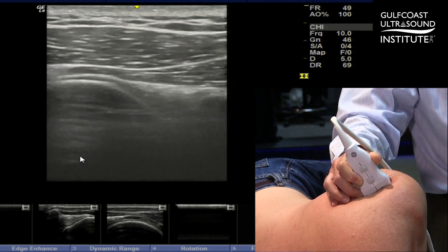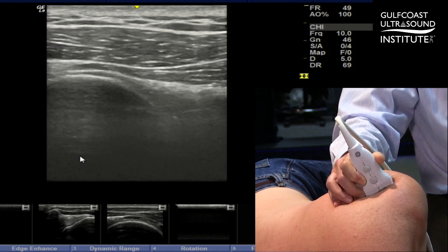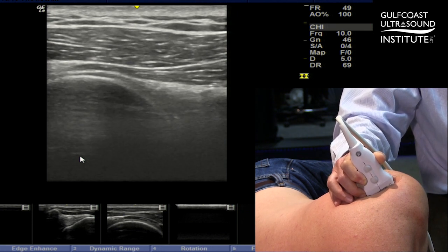The difficult thing that I personally sometimes have a challenge with is that you'll have the convexity of the humeral head almost sitting up above the glenoid, getting in the way of your trajectory of approach when doing an injection into the glenohumeral joint.